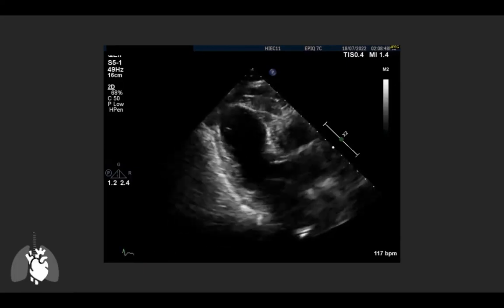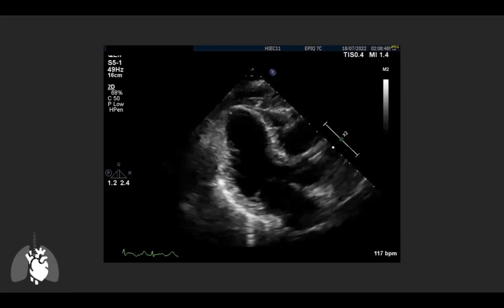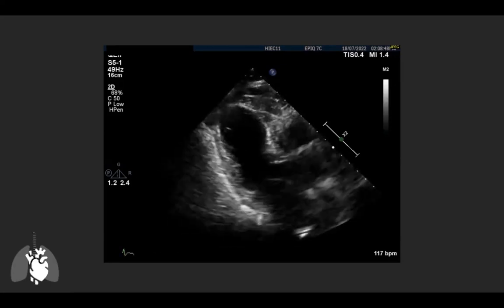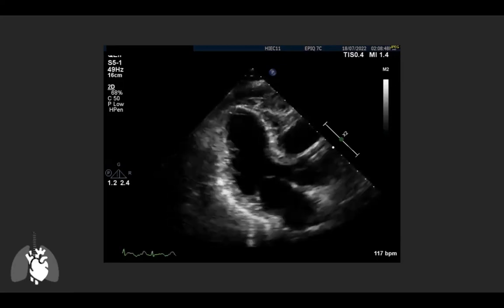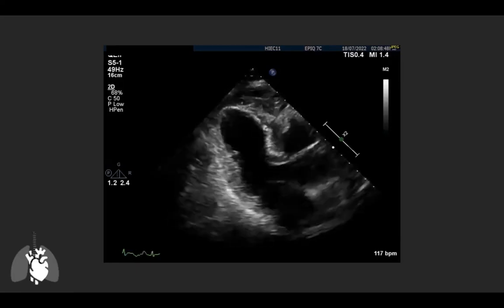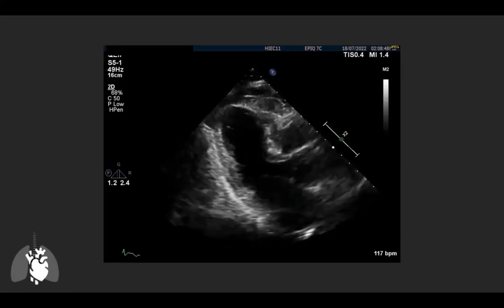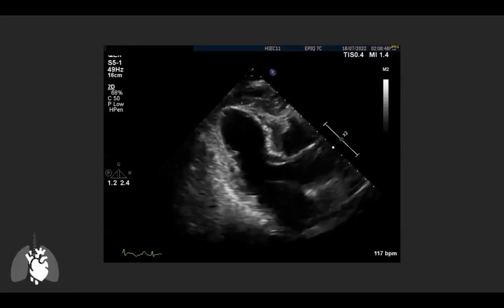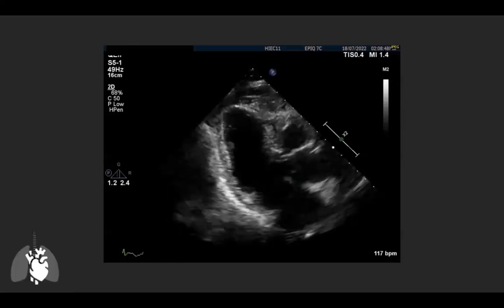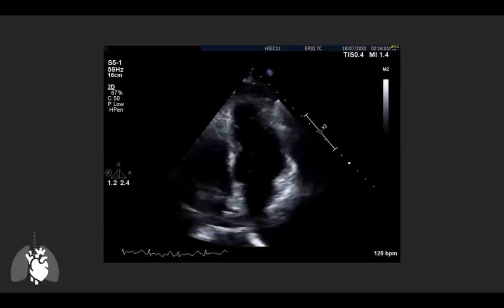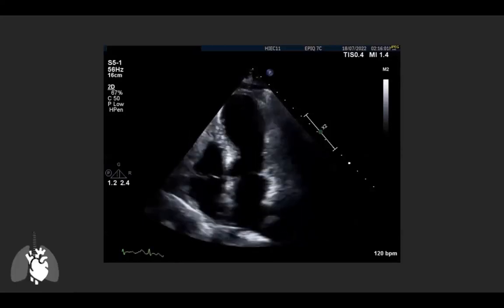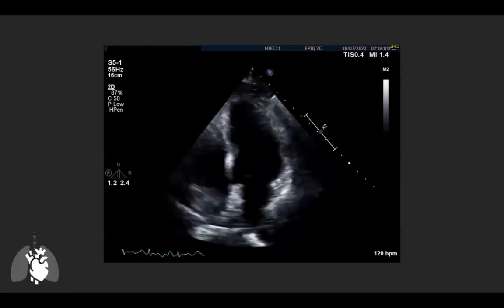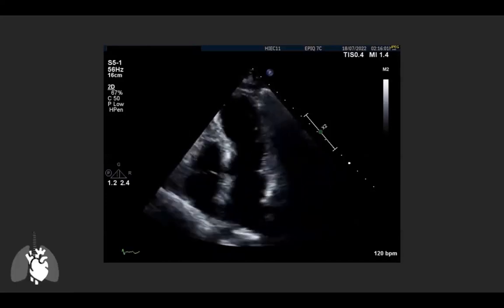Despite the imperfect view, at the basal level you can see a hyperdynamic LV — the walls are nearly touching and contracting vigorously. However, as you move toward the apex, there is severe hypokinesis progressing to akinesis. In the apical four-chamber, the basal segments are hyperdynamic while the mid and apical segments show almost no contraction whatsoever. RV function looks reasonably well-preserved.